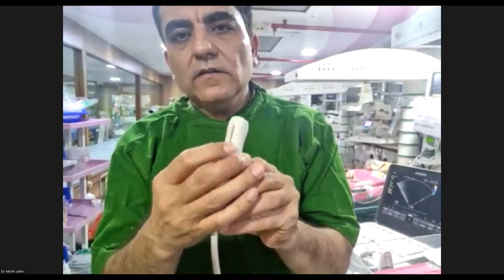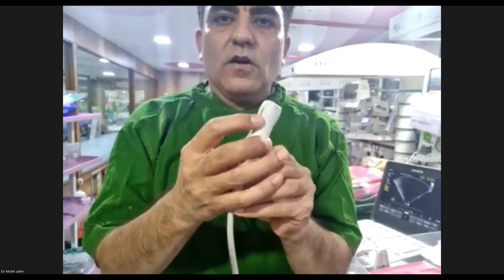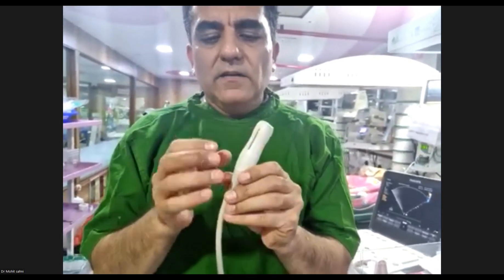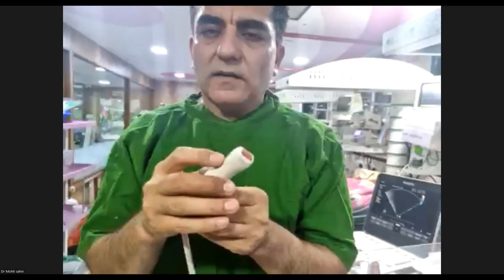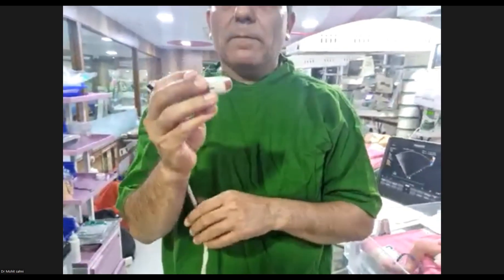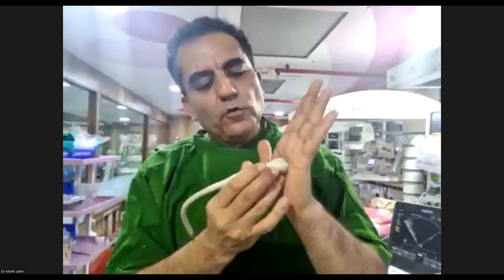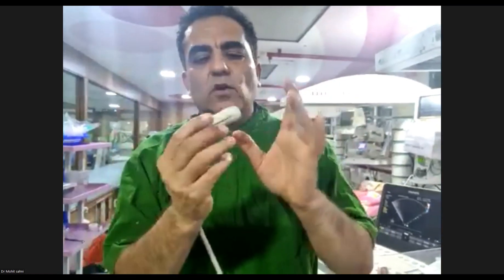What you see here is the probe marker — the one I always talk about, at 12 o'clock, 1 o'clock, or 11 o'clock. Every machine and probe has its own style — some have a dot, some an LED, and this machine has a big crossbar. This is your probe marker. This is your probe and this is your probe tail. When I talk about tilting or sweeping, that movement is always with respect to the foot of the probe — sweep up means the foot sweeps up, sweep down means the foot sweeps down.